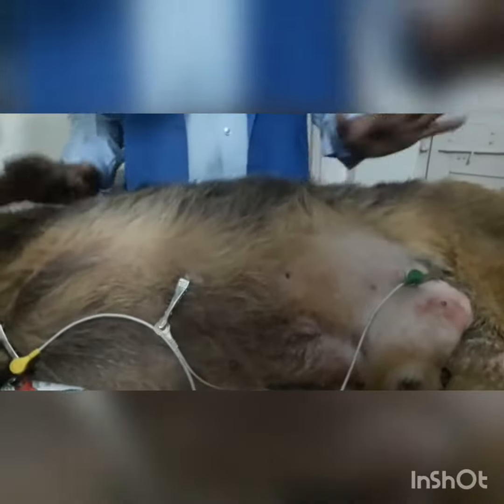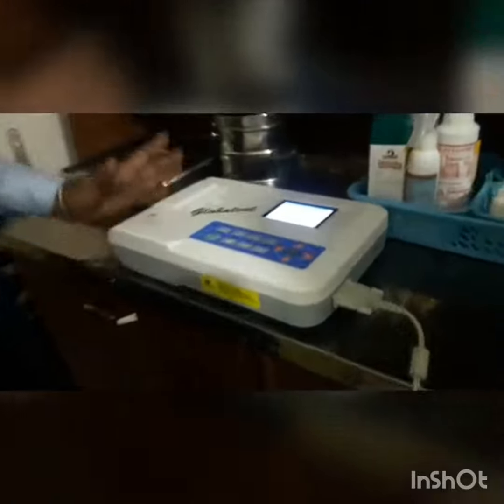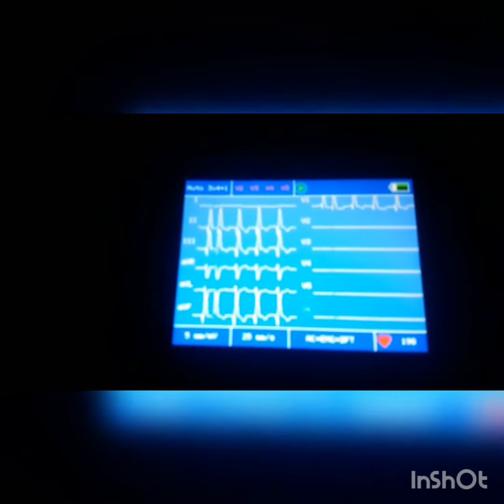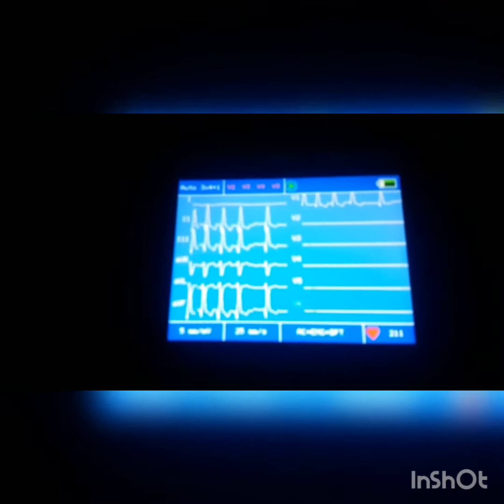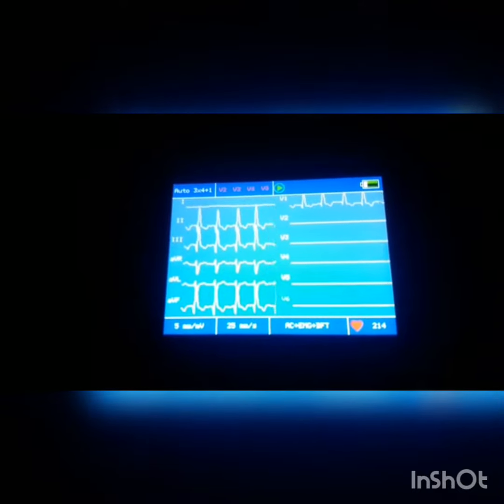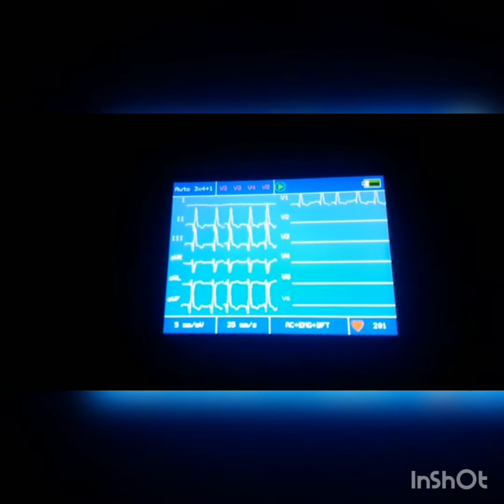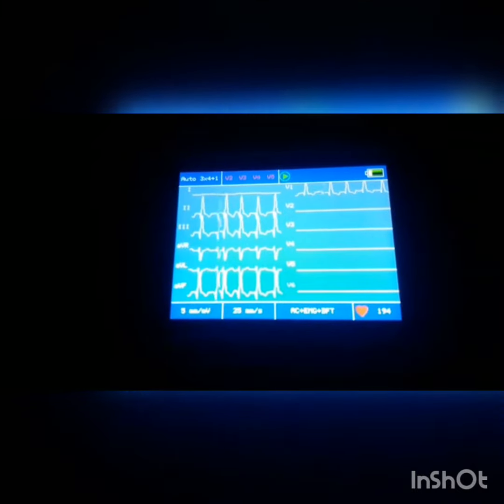Now I will record the ECG of this dog. I have started the machine already. This is the ECG pattern you can visualize, which I am recording for this dog. After 30 seconds we can take a print. I hope it is clear how to take the ECG of a dog.